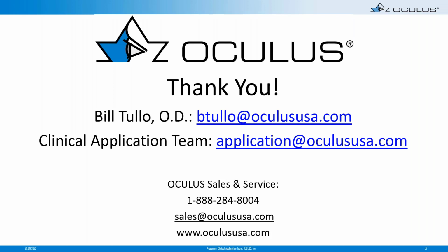So it's really important when you are pulling lids out of the way for this imaging that you don't put any pressure on the globe. That is really what can vary the map significantly. So training your technicians how to lift lids or lower the lower lid is really important, so that they are not simultaneously pressing on the globe. And we have a device called the lid stick that I think is very handy and useful, and an easy way of taking lids out of the way of the scan without applying any undue force on the globe or the cornea.